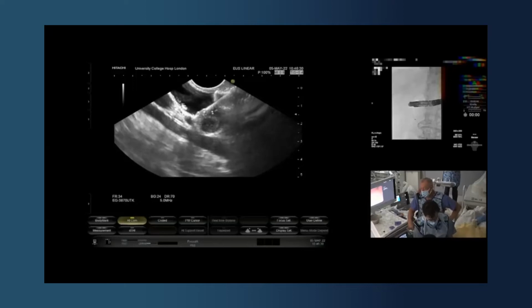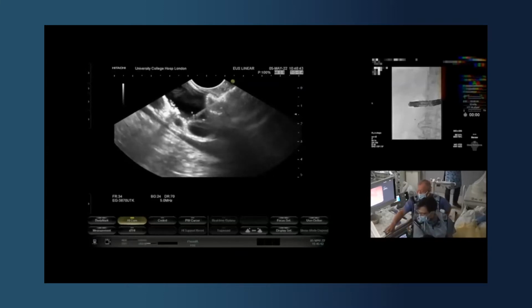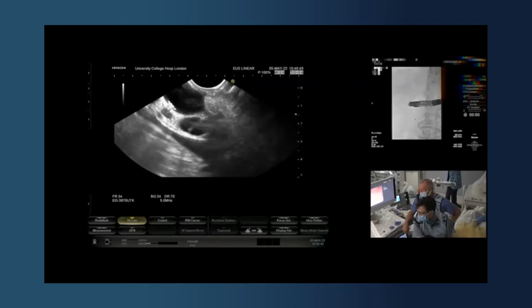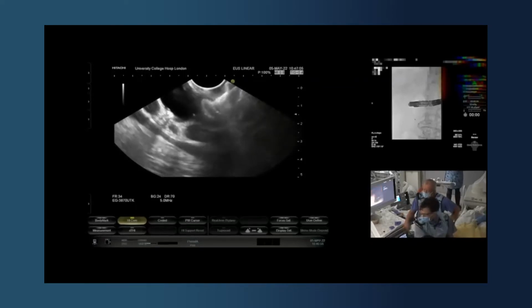And then generally we deploy the proximal flange, usually in the scope, making sure that the elevator is off, and just turning slightly rightwards as you're deploying, doing this by endoscopic ultrasound, making sure that the intrabiliary flange remains in the bile duct at all times. Yeah, very good, keeping that view, that's very nice. It's almost there. Good. And then you make sure the elevator is off now.